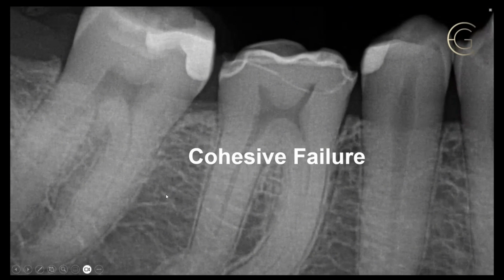So if you're using a product like lithium disilicate, lithium silicates, or zirconia, it is so highly polished and shiny that it won't pick up with your Bausch articulating paper. So you have to take a little dollop of Vaseline, unless they're asthmatic. Do not use Vaseline if somebody has asthma. And then you're going to have them do their excursive movements. Believe it or not, I had a working interference that I didn't catch at the initial appointment 6 months prior. So we adjusted it out, and now this is approximately 10 years with no issues.